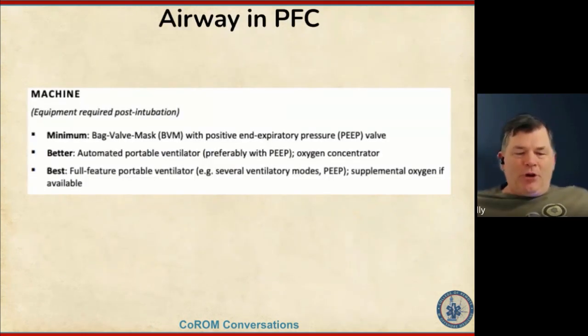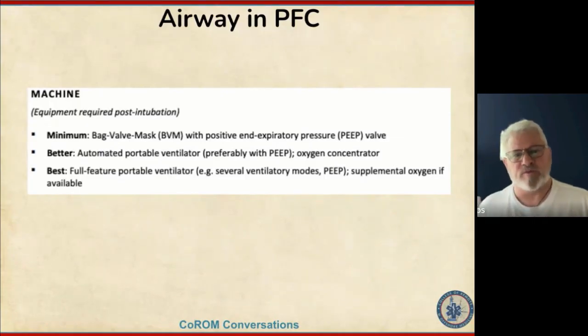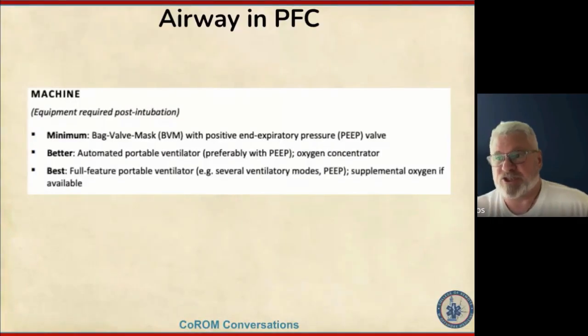So MISMADE, we're going to start talking about MISMADE. What's MISMADE? MISMADE is definitely something that you need to consider when you're considering an advanced airway. But I would expand this to any medical procedure. If you expand the MISMADE mnemonic to preparation before doing any procedure, whether it's any minor surgical procedure, I think you can expand this to any other procedure, but it was designed in the original format for the advanced airway. So it encompasses making sure that your machine. So what are you looking at?